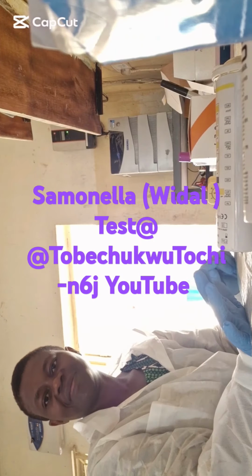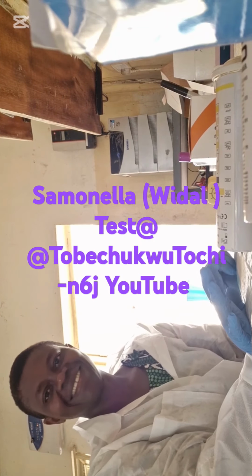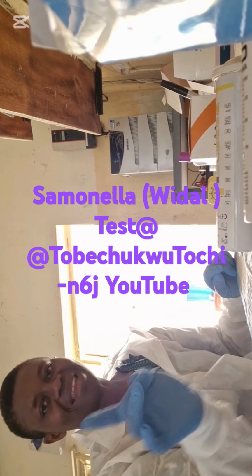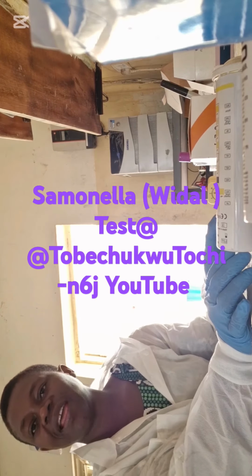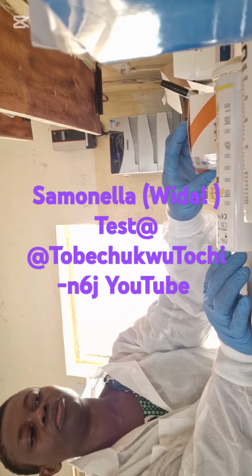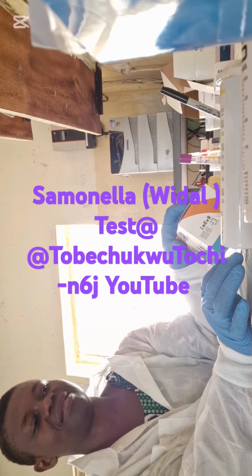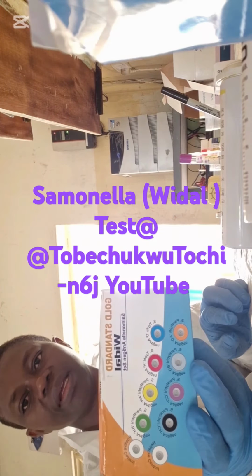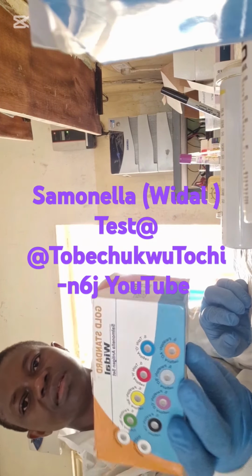Alright, hello friends. I want to show us the typhoid test, but for us in the lab we don't call it typhoid, we call it the Widal test. For you it's typhoid, but here it is Widal.